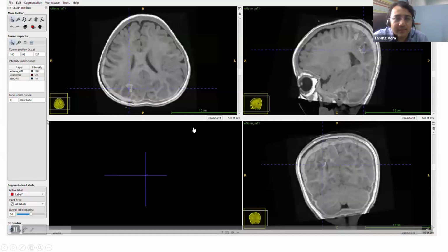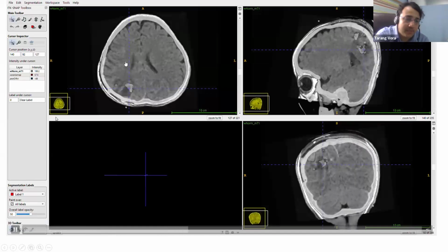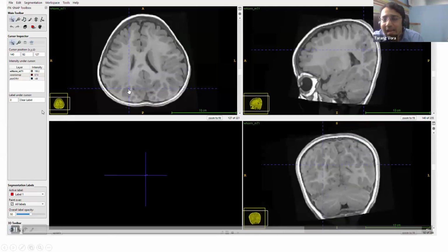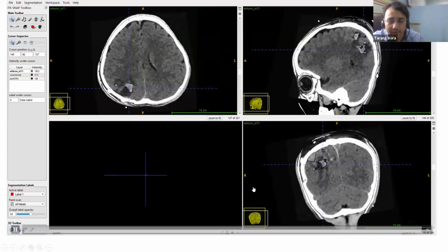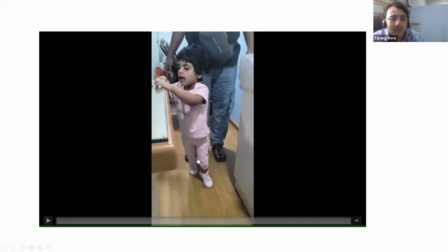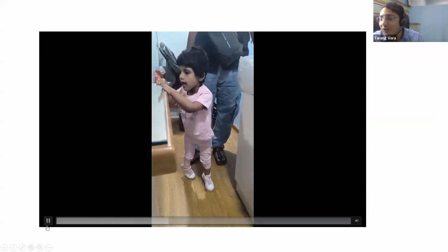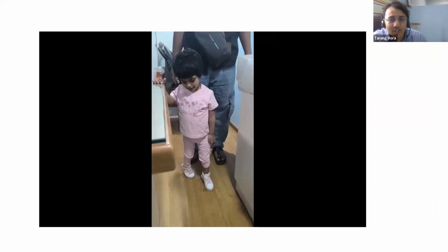And this is our post-op scan, merged on the pre-op scan, where we are seeing the area of resection that we had planned based on the PET, the texture analysis, and the morphometric analysis. And this is the child at 3-month follow-up, still doing better. Now, of course, she can sit with support. She's able to stand with minimal support. She has come a long way. Her development milestones have started to improve. She is seizure-free so far.